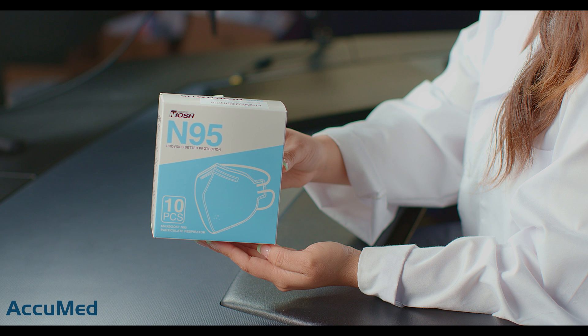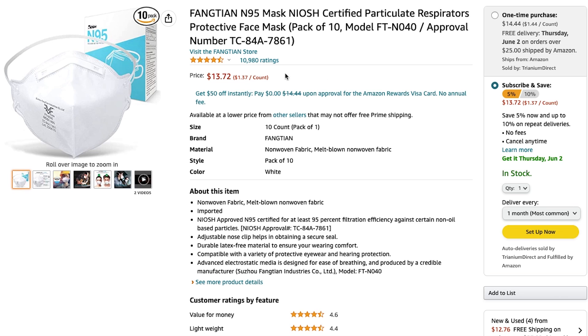Hello everyone and welcome back to the Acumen channel. Today we're going to be reviewing and testing the Fangtian N95 respirators. These respirators are made in China and as you can see from the listing, they come in a pack of 10.